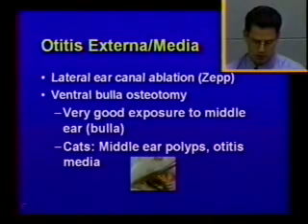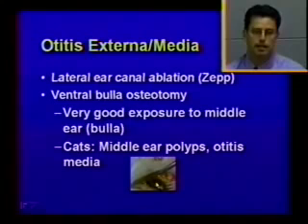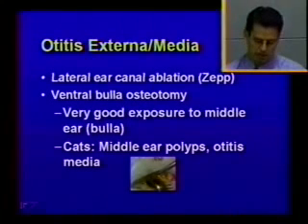This picture shows the approach to the bulla in a cat. Can't see it too well, but in retracting the lingual nerve, we then get exposure to the bulla, and we make a hole into the cavity and debride the contents of the bulla with a bone curette.